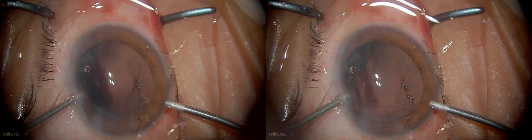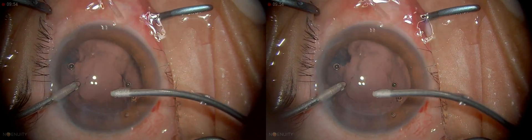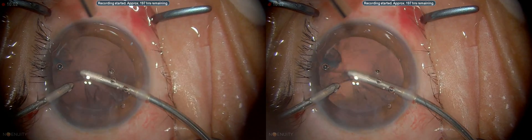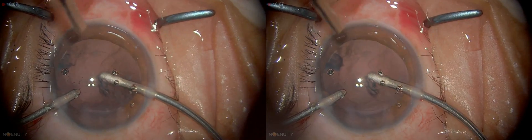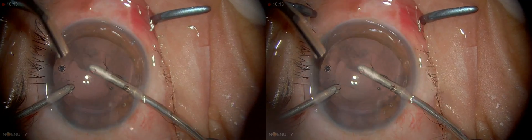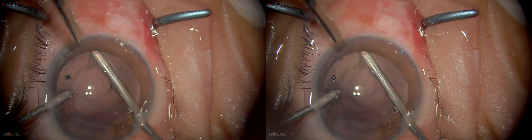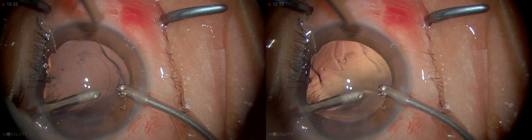Now I'm going to go into bimanual. There is a little sandblasting at the edge which can be used to polish the capsule. I go in and they have a nice curve to enable access to any part of the subcapsular area. You remove the cortical material through a radial incision and I'm just going to polish this as well. There's a little bit of fibrosis there — we just leave that alone, it's not going to cause any problem.